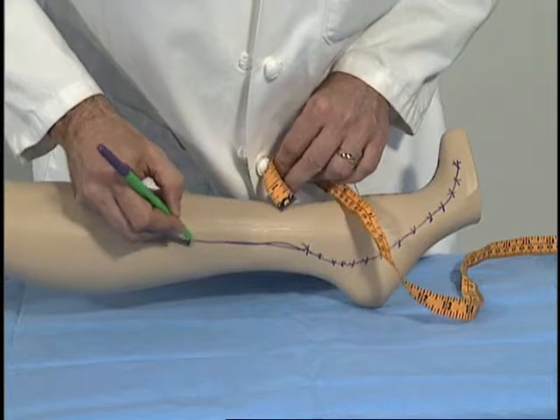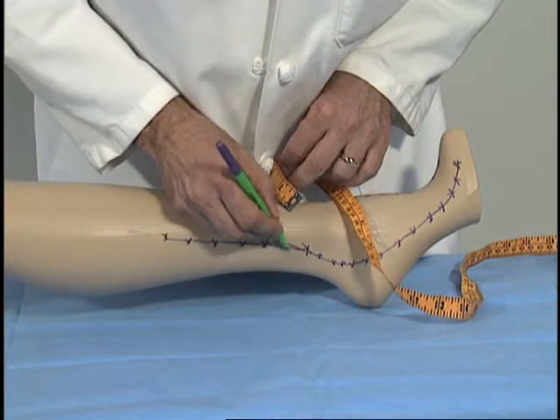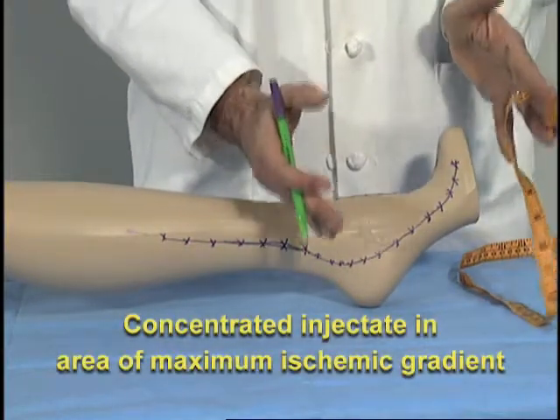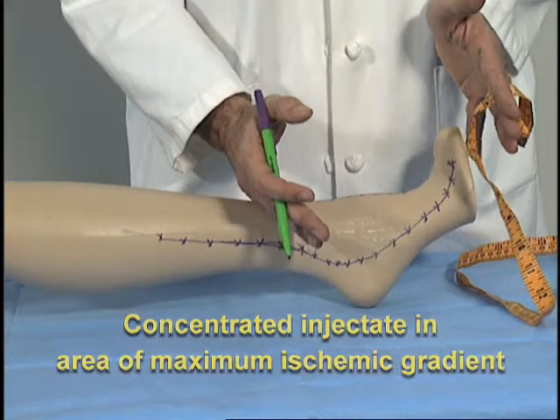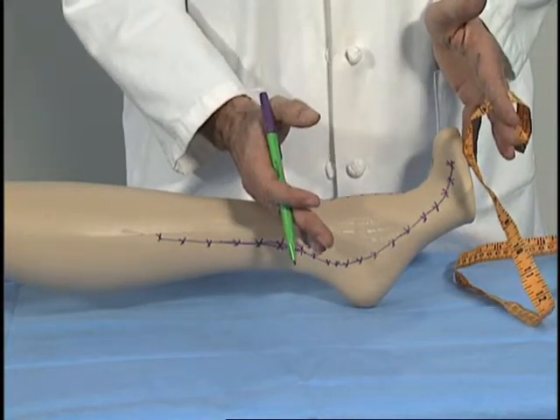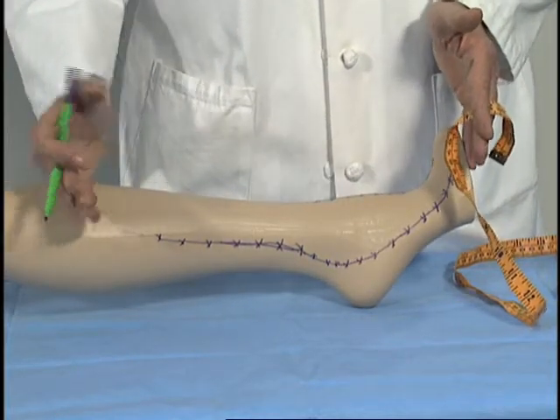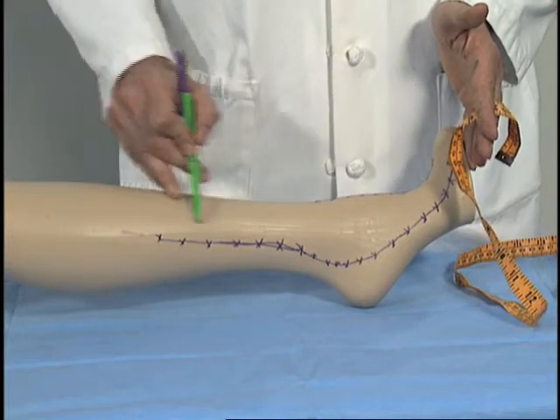So we'll get our final 7 injections at 2 centimeter intervals, and we've concentrated the injectate in the area of the maximum ischemic gradient, in the area where we most would like to see clinical benefit, and then we have distributed the remainder of the injectate where we think there'll be additional benefit in terms of bringing the flow into the field.